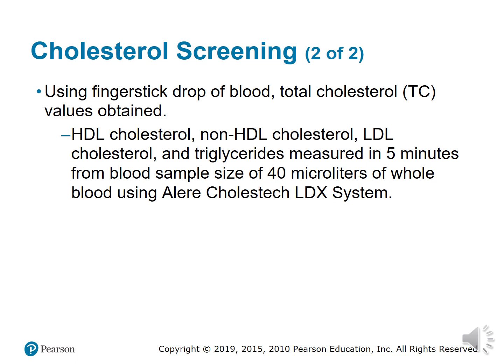It can also test for HDL, LDL, and triglycerides in a person's blood system within 5 minutes. It can use only 40 microliters of whole blood, and the instrument that they use to check your total cholesterol levels is called the Cholestech LDX system.